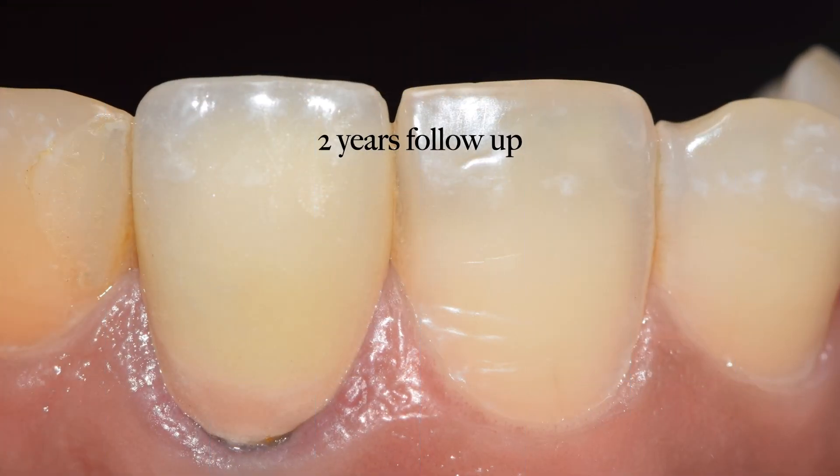The zirconia crown was saved, the tooth was saved, and eventually things became more predictable.